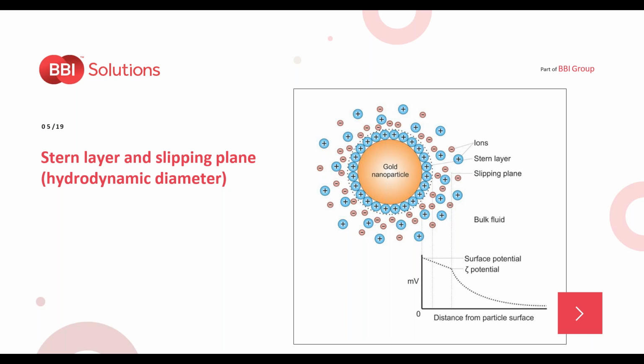This is known as the Stern layer. You can treat the system as being like the planes of an electrode: an electrode immersed in an electrolyte, which is where the initial modeling of the surface charge was first done.